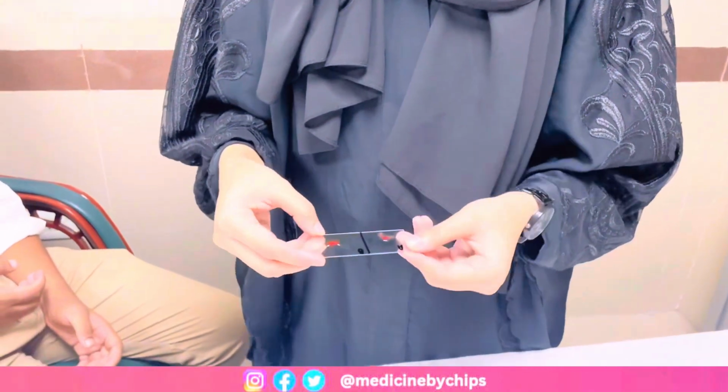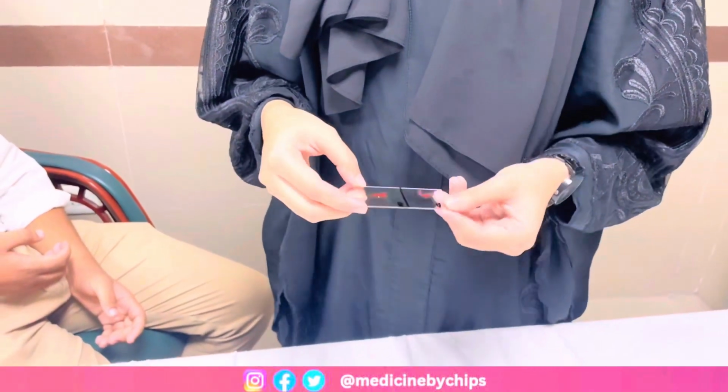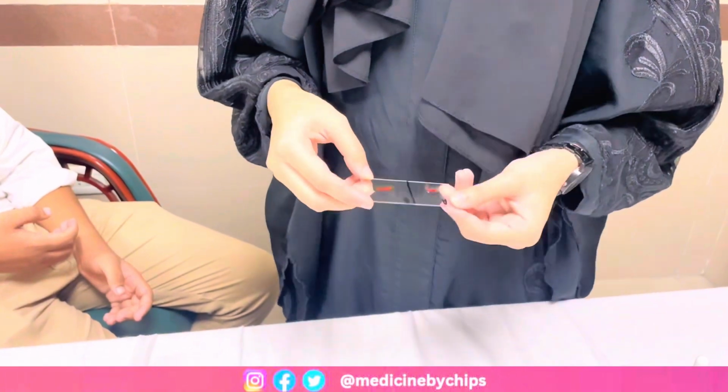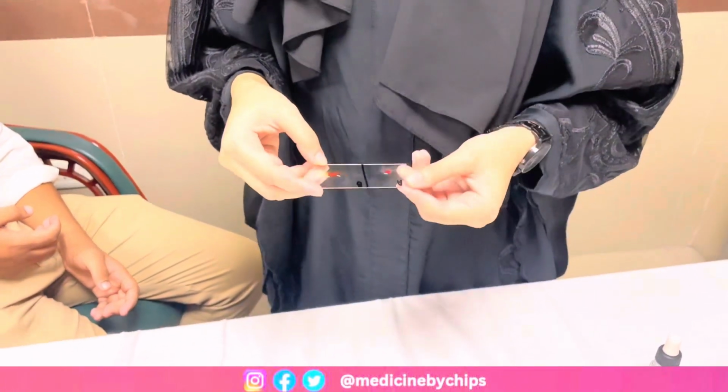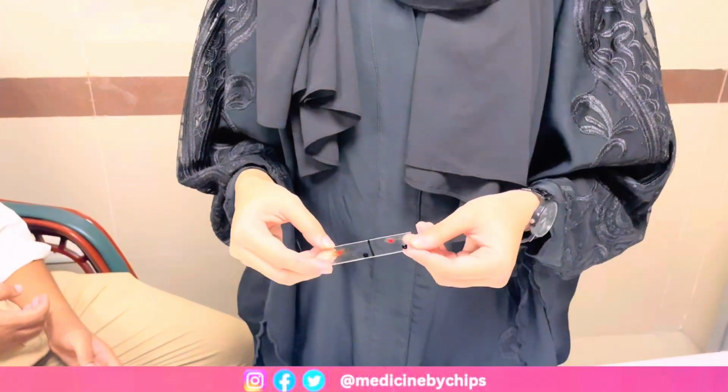Basically, you have to roll the slide for 2 to 3 minutes in order to check for agglutination. After that, there will be clumps of RBCs. If agglutination occurs on side A, this means that the patient has blood group A because his antibodies reacted to those antigens. And if agglutination occurs on side B, it means that the patient has blood group B. And for RH, if agglutination is present, it means that the blood group is positive, and if agglutination is absent, it means that the blood group is negative.